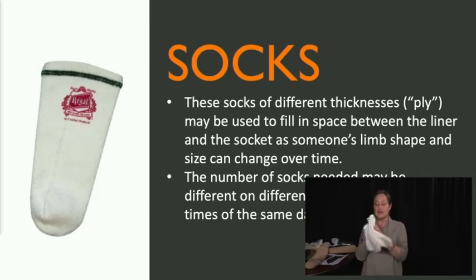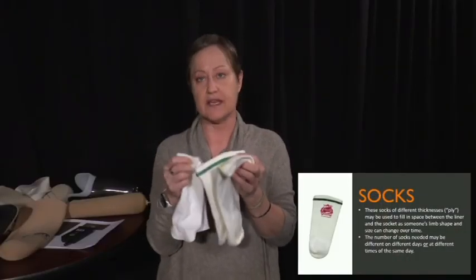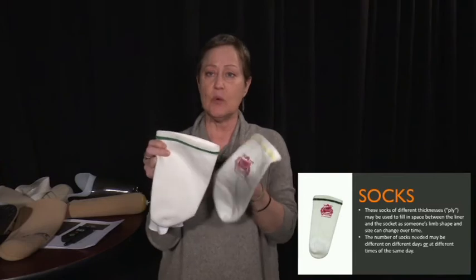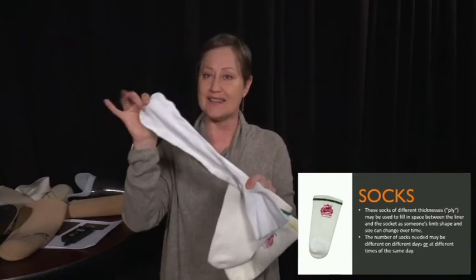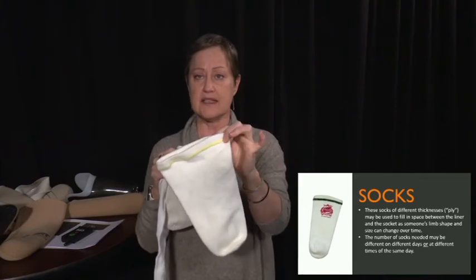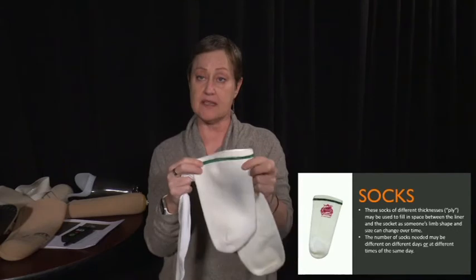So the general concept is the patient will get socks of different thicknesses. Talk to your local practitioner about the kind of socks they use. These are the ones that our company uses. So there are 1-ply socks, and that's the foundation. You add 1 ply at a time. There are 3-ply socks, that's the yellow stitching, and there are 5-ply socks, that's the green stitching.